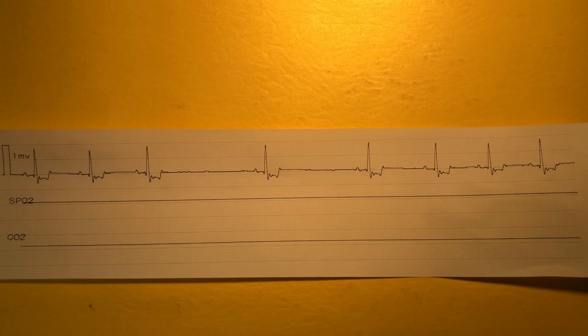When we evaluate our ECG, we're looking at 4 basic features: the heart rate, heart rhythm, a measurement of waveforms in the intervals, and the mean electrical axis. The vertical measurement of our complexes represents the strength of our electrical impulse, and our horizontal measurement measures the time in seconds. What we're looking for is the rhythm of our heartbeat. We want to know if it's regular or irregular. Austin actually does have an irregular rhythm, and we can see it here.